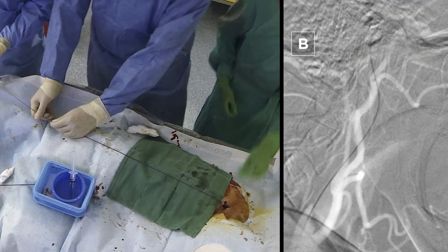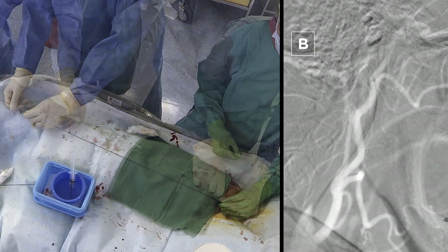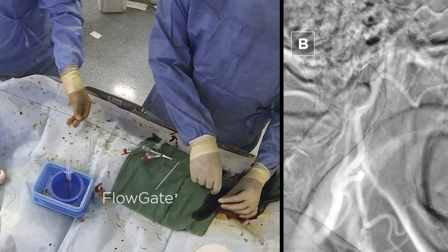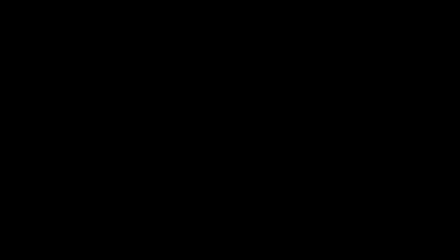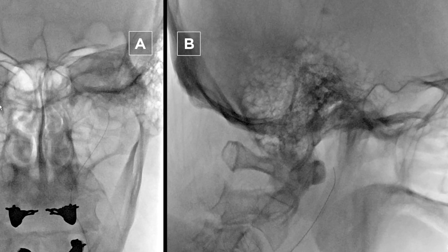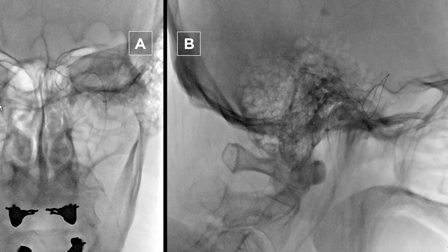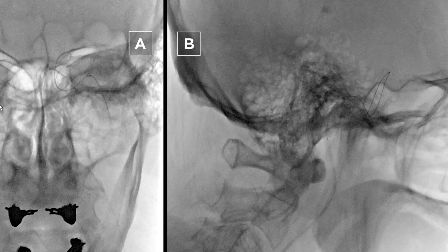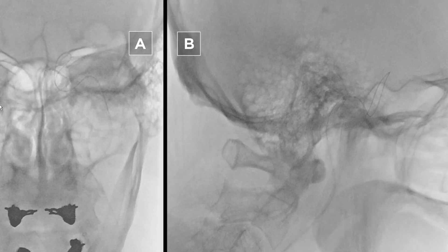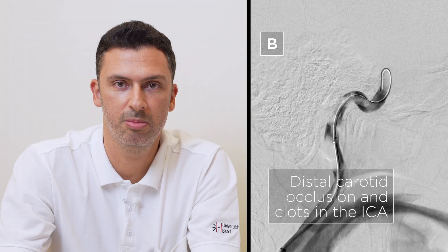Here is a typical setup. We start with an 8 French femoral sheath and then exchange over a long Terumo wire for our balloon guide catheter, which we place in the proximal carotid. On the angiographic series we can see the distal occlusion of the ICA proximal to the origin of PCOM. We then advance the aspiration catheter over the micro catheter and micro wire. As seen in the series, there are large clots within the proximal ICA and then the occlusion in the distal part of the carotid.